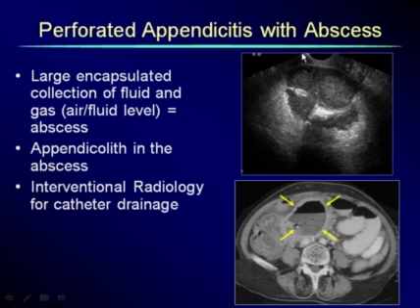Now we're looking from below. We're looking transvaginally from below, so we have a pretty good chance of seeing the pus and the fluid component. If we were looking transabdominally, this gas that layers here would interfere with seeing the entire abscess, and also if there were bowel loops overlying this, we wouldn't be able to see. So here's this whole area of inflamed bowel, and there's an interloop abscess here, and the rest of the bowel being pushed over. These type of patients need drainage.